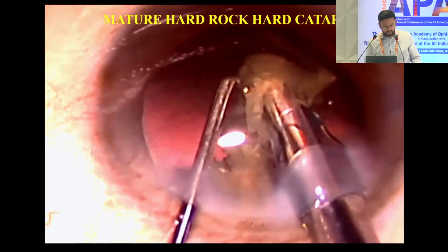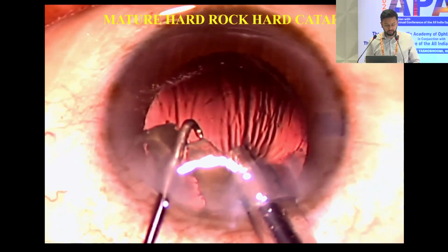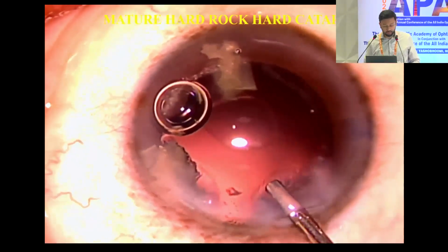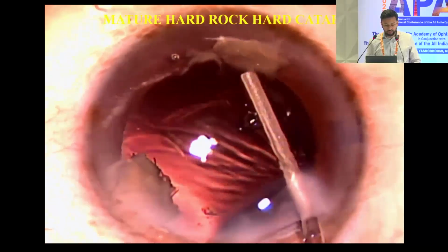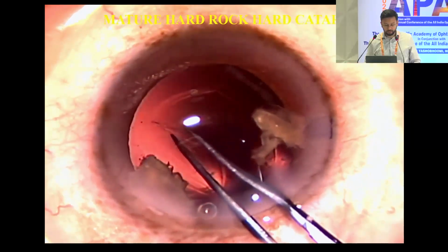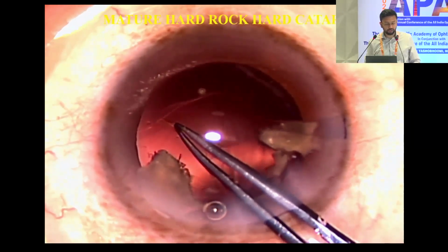So this is a case of a mature hard cataract. While aspirating the final few fragments, we see that we have created inadvertently a posterior capsular tear. So here we immediately stop and put lots of visco, form the chamber, mainly to move the fragments away from the tear and push the vitreous back.